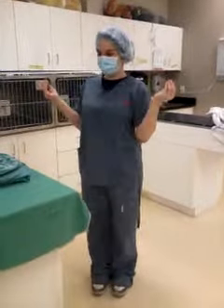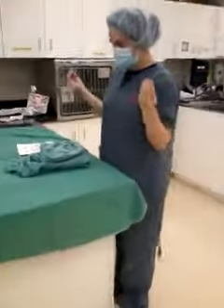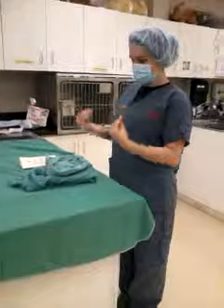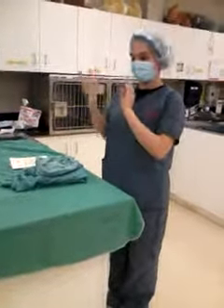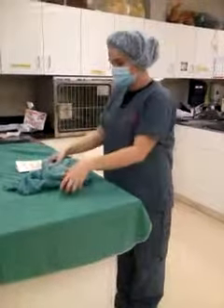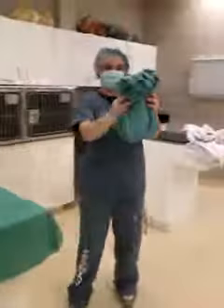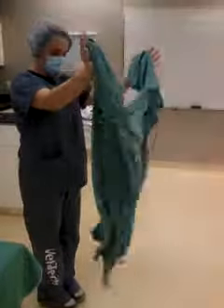Hello! So this is going to be gowning, or donning my gown. I have my sterile shield, my gown, my gloves, and a hand towel. I rinse off my hands, dry them off, grab my gown like so, stand in a sterile area, and let it drop away from me.